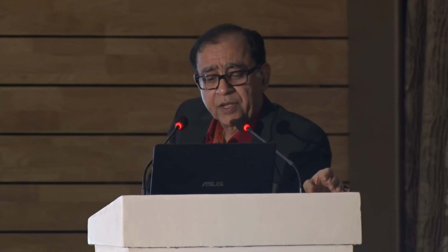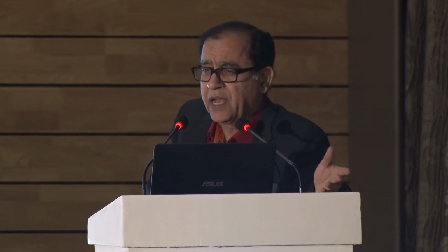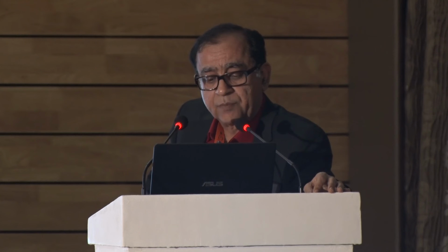Now this patient actually had more than 36, 38 RK cuts, was an NRI, came to India and was more worried, had high myopia, had a very poor vision, more worried about the white opacity shining through all the time and had a squint. So wanted to go for a squint surgery for cosmetic reasons and wanted this white opacity removed. So you can see that in these cases, the Zeptorhexis can be done very well.